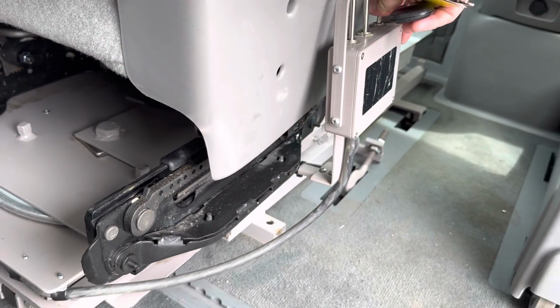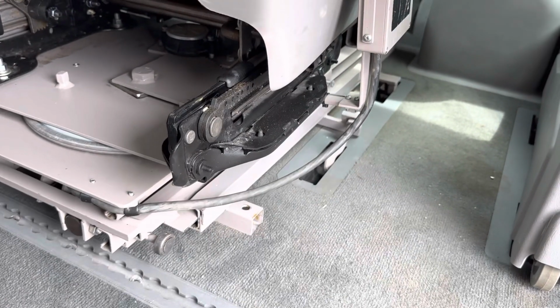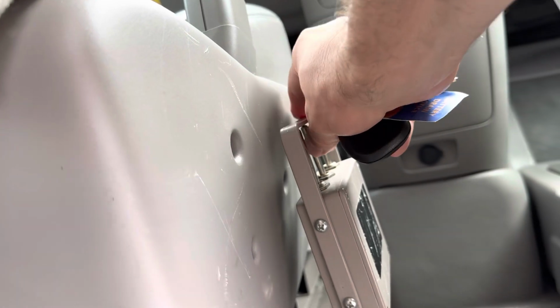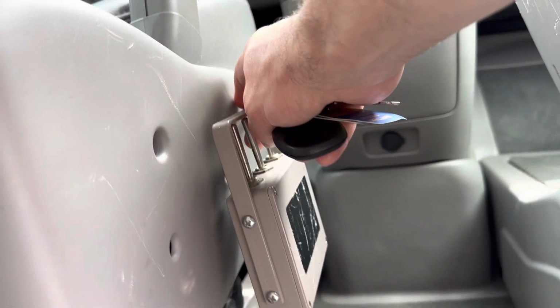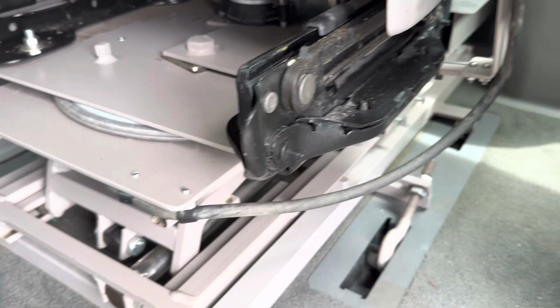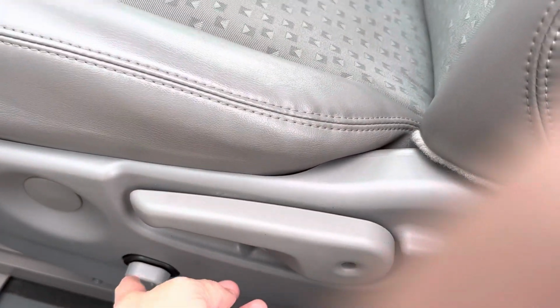One thing to note with the power transfer seat, you always do need it to go to the home position, meaning all the way back left and all the way forward on the transfer seat switch box, in order for the vehicle to not scream at you, because it doesn't want you to be in the wrong position when you're driving. The up and down function doesn't play into that. You can adjust it as needed. And then of course you have the original controls on the seat that you would adjust as you need.